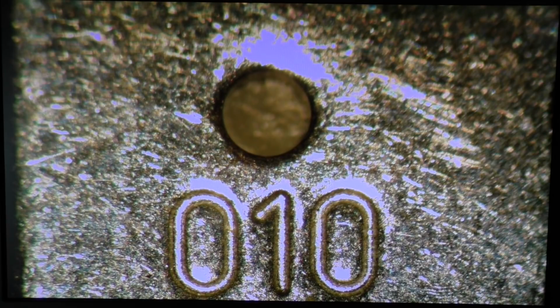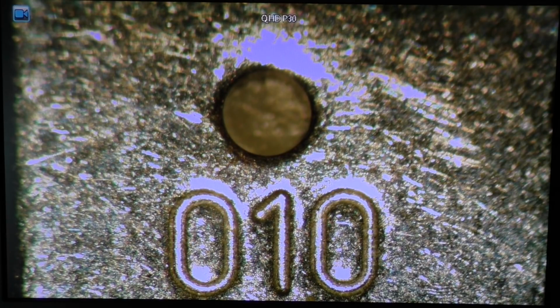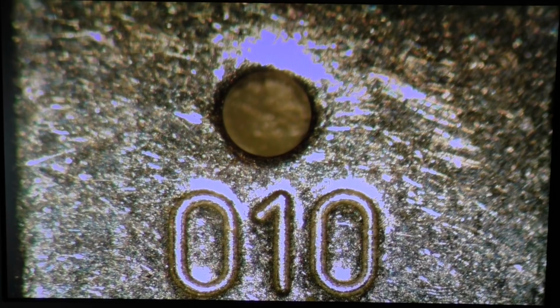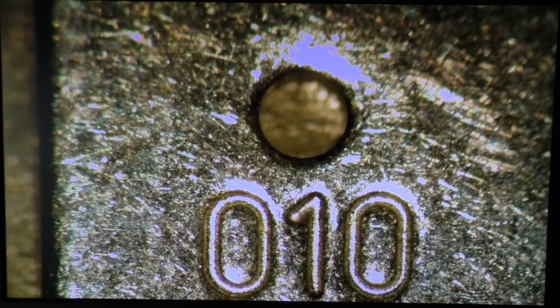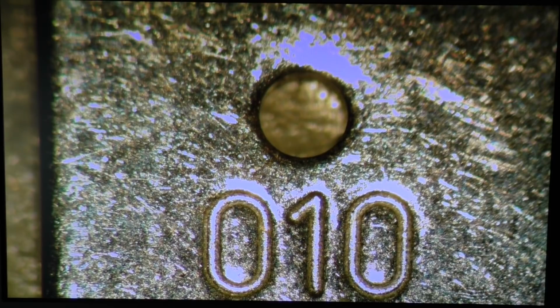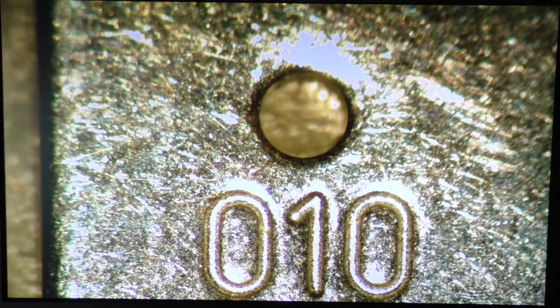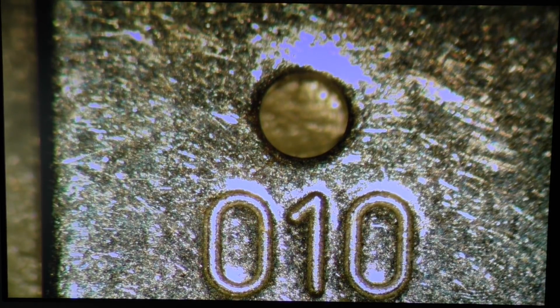So first of all, let's try to set it to the photo. I think that's it, probably, yes. We can take a picture with the remote control or directly on the camera, but in this case I prefer the remote control. Yes, picture goes black for a second. I think we have stored now something. Let's try this. Still picture. Yes. Okay.